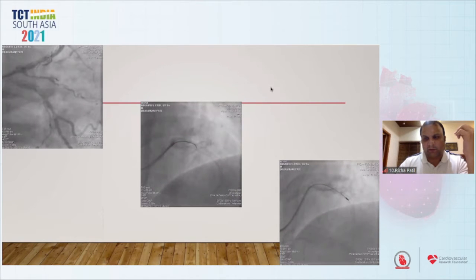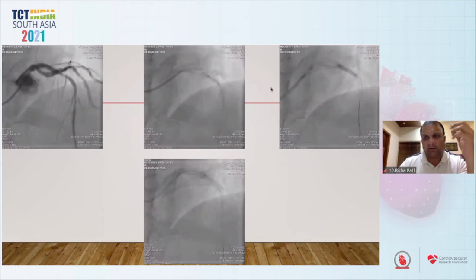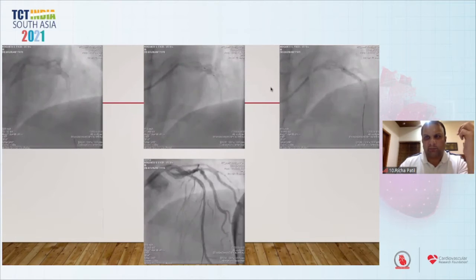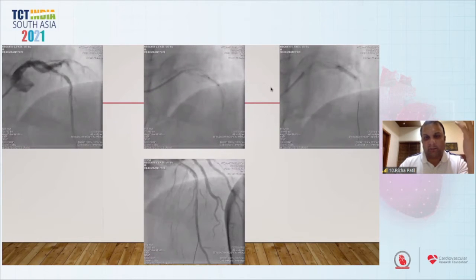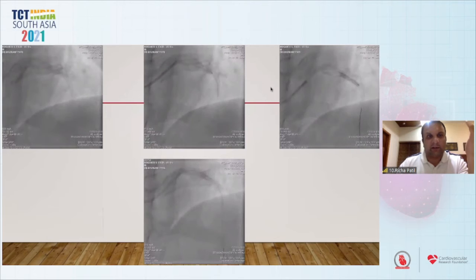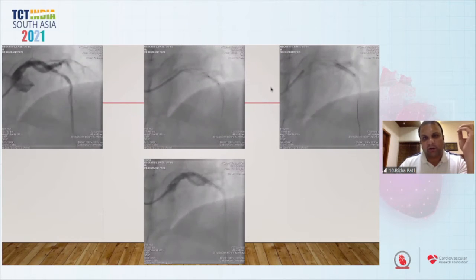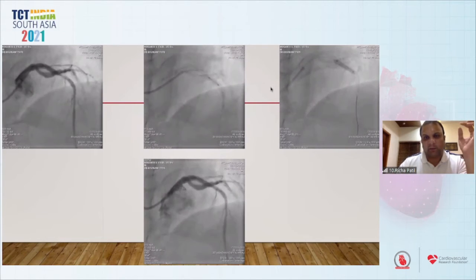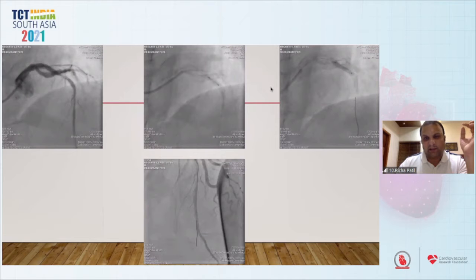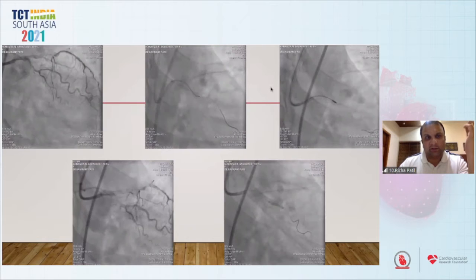Lesion, and then a routine balloon, then dilatation of the lesion, and finally putting a stent. So sometimes Rota in this kind of lesion is very easy. You think Rota ablation is very easy in this kind of case. You just cross the LAD, put a burr there, and then come across. But then Rota can be nasty in the cases where the lesions are very severe.